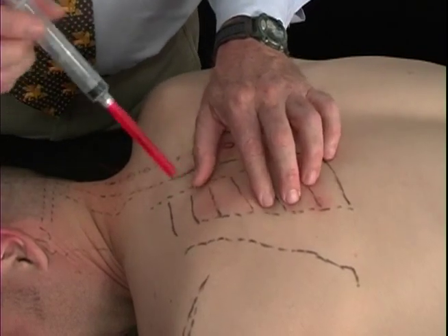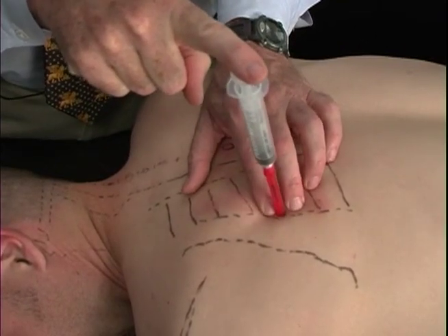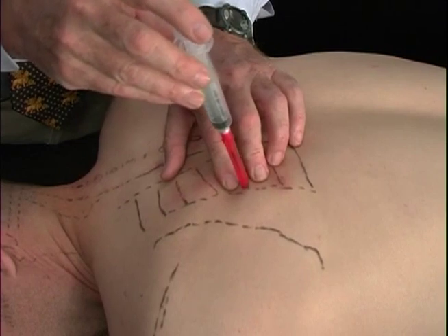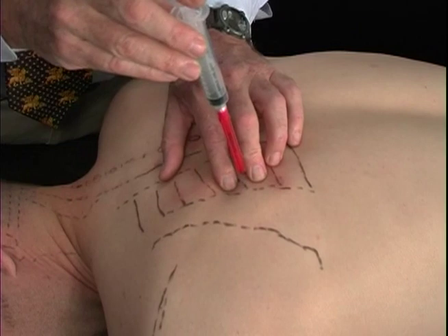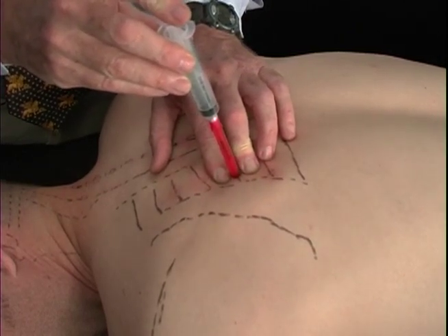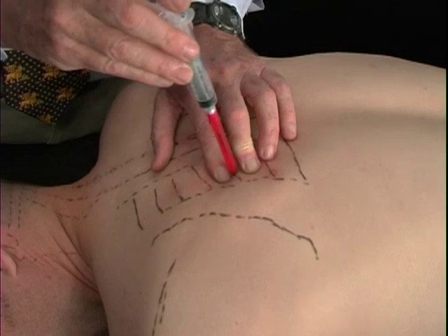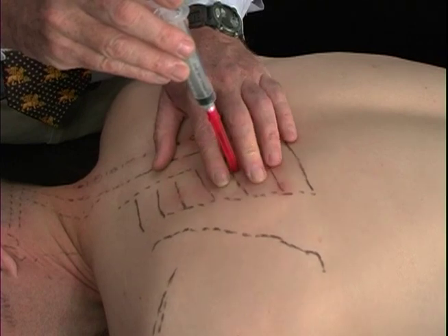One can also rib skin slide in this area. So you can come in, and this is another injection technique, come into the rib right here, and then come back out to the skin level without coming out of the skin, and slide the skin over like this, go back in, re-inject when you hit the rib, slide the needle out, come on over, and go back in again to the same spot. And then you have to remember, though, that you've skin slid across. So I'm going to keep my needle right here to where we are, and I'm going to let the skin go, and we'll see how far over we were.